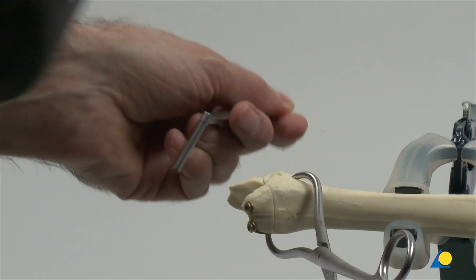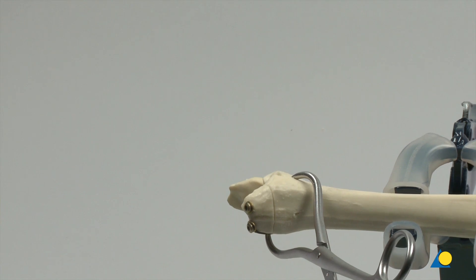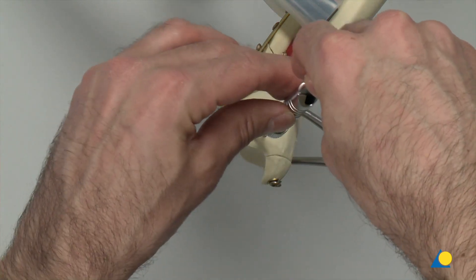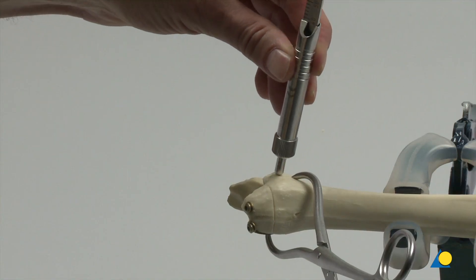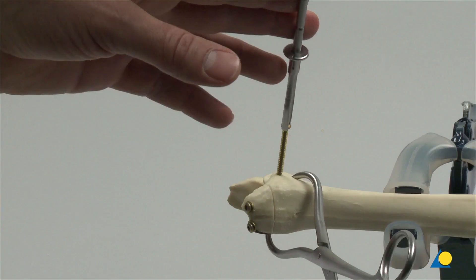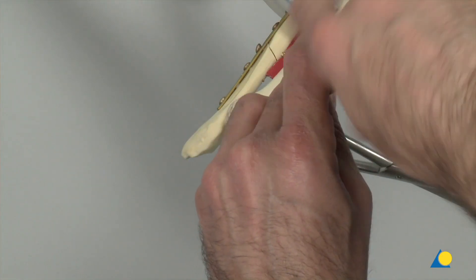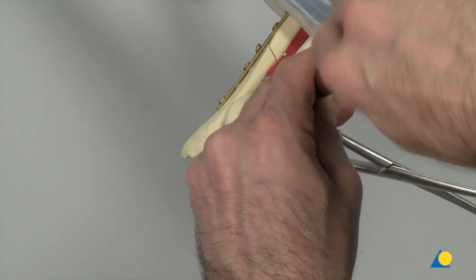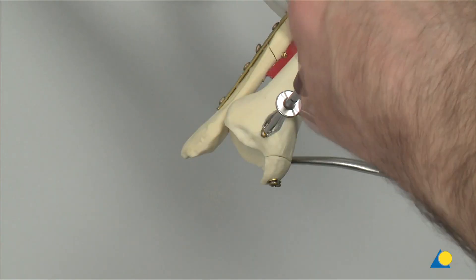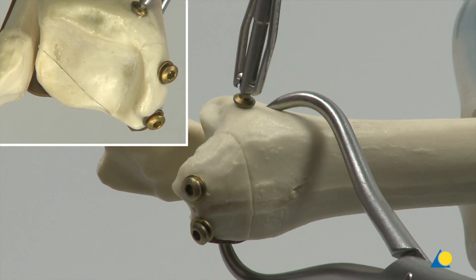However, the 4.0 mm partially threaded cancellous bone screws with 2.5 mm drill bit technique can also be used. The depth gauge is used to measure the required length of the screw. The hexagonal screwdriver is used to insert the 3.5 mm self-tapping cortical lag screw. The compression effect is clearly visible at the fracture line.